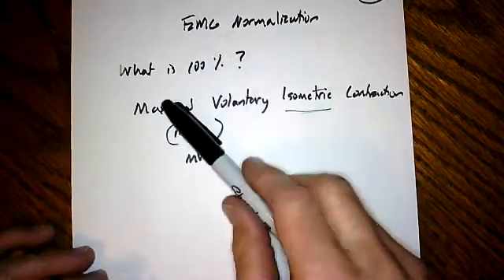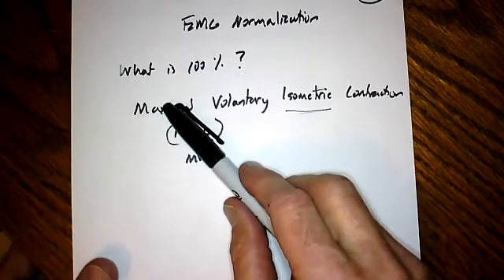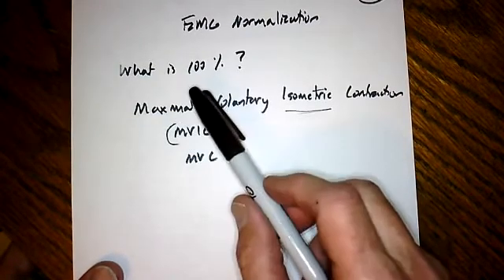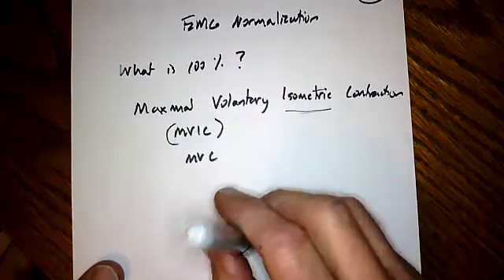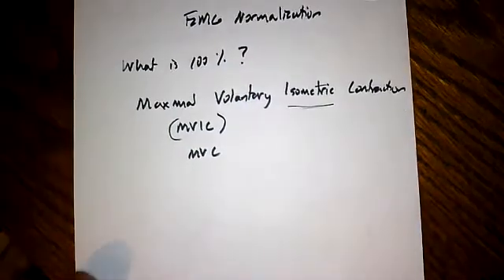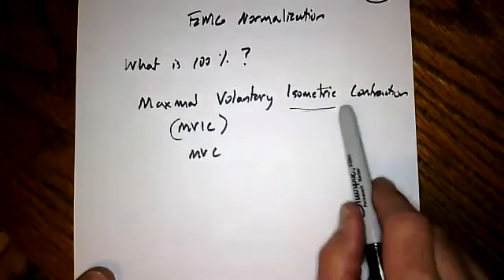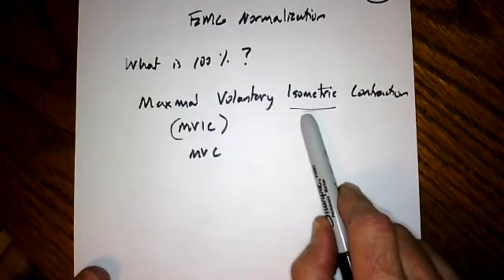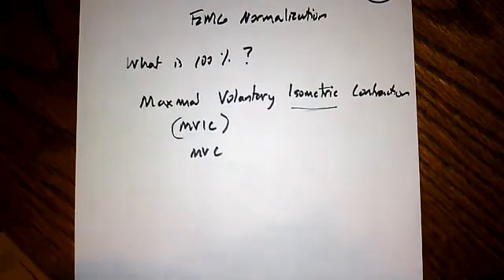Again, from ground reaction forces, we measure body weight. That's easy. Stand on a scale, that 100% force is called 100% body weight. So if we see 2 times body weight, that has a meaning. It's 2 times the person's standing weight. But MVIC is a little bit tricky, and you'd have to do MVIC for each muscle. You don't do it in one contraction. So if you're doing 4 muscles, you've got to record that 4 times, 4 different actions in 4 different muscles and 4 different data sets.